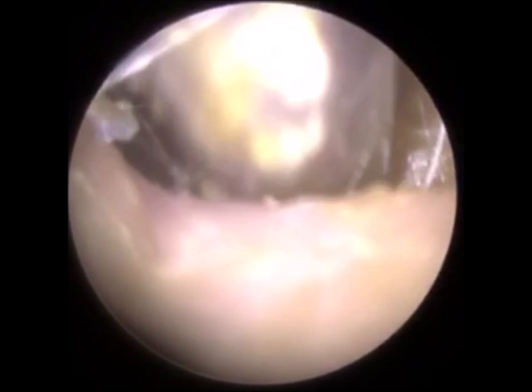Yeah, and I was saying before, sometimes with wax or keratin, you have to reposition it. It's like when you're moving a piece of furniture from one room to the other, you have to get it at the right angle, because obviously that sofa or bed is larger than the door frame, and you have to get it at the right angle to allow it to be maneuvered through the door into the other room. Just using an ear hook now, just trying to get in behind this plug of keratin, which I have.